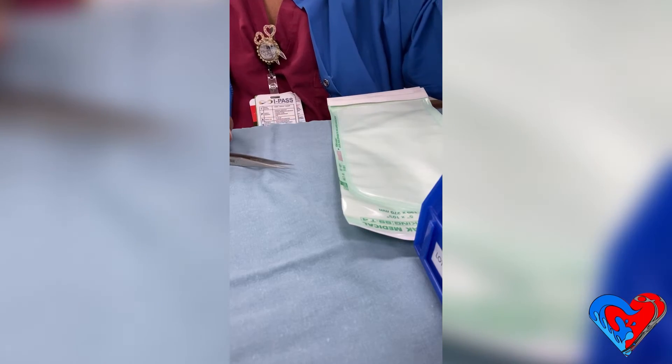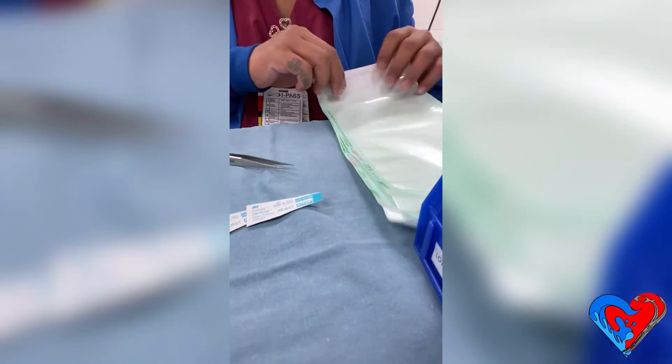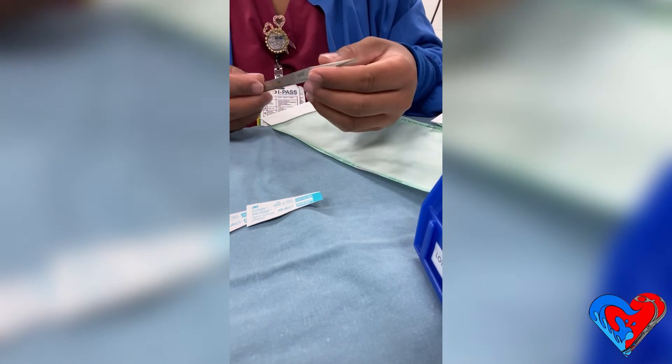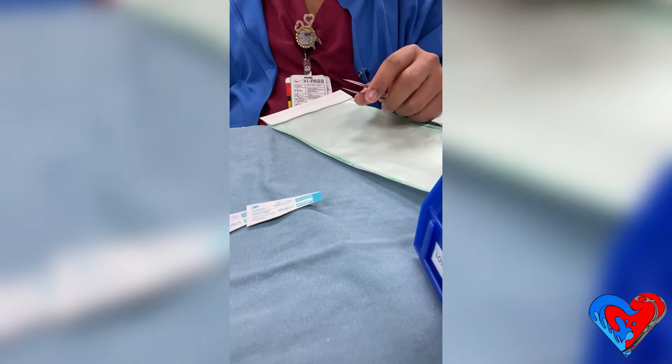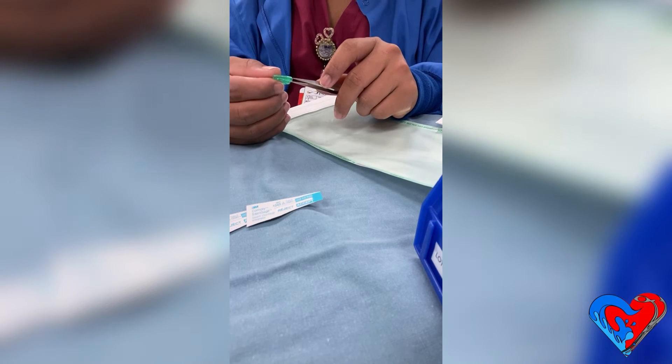This part is optional: I like to count all the instruments I'm going to pill pack and pre-print all my labels. Once I have pill packed all of my instruments, I will label each one and put a lot sticker on each pill pack, then load them onto the sterilization rack.